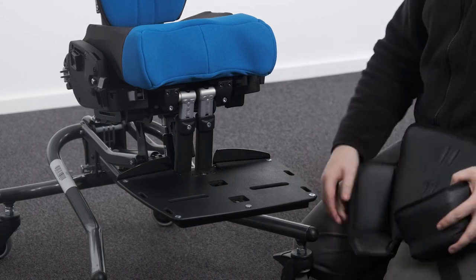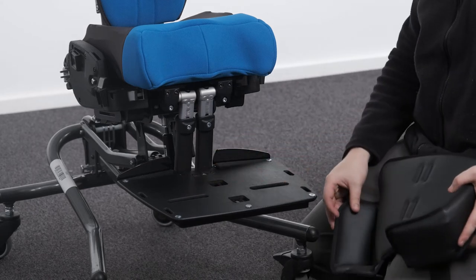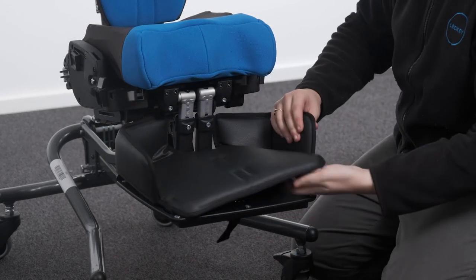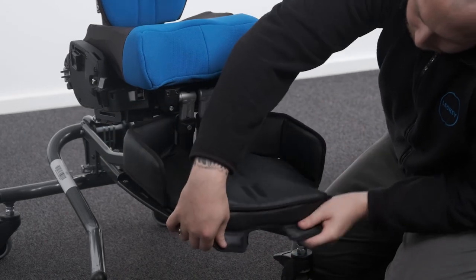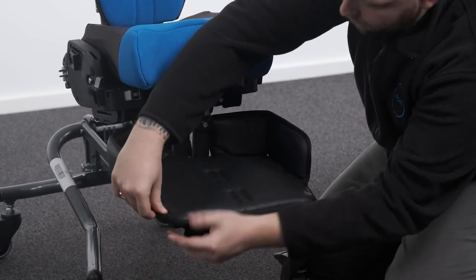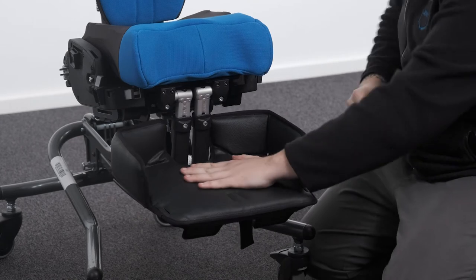Attaching the footrest cover. To attach the footrest cover, first remove any hardware or straps that are attached to the footrest. Place the cover over the top surface of the footrest so that the raised sides of the cover align with the back and sides of the footrest. Secure on the underside using the straps.